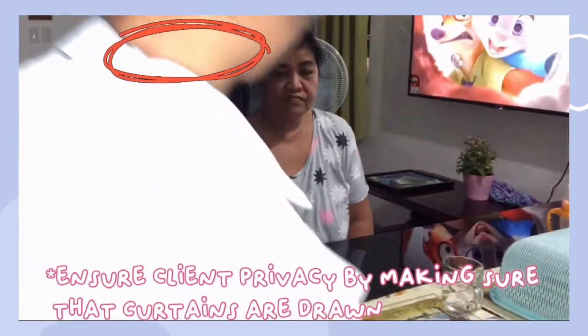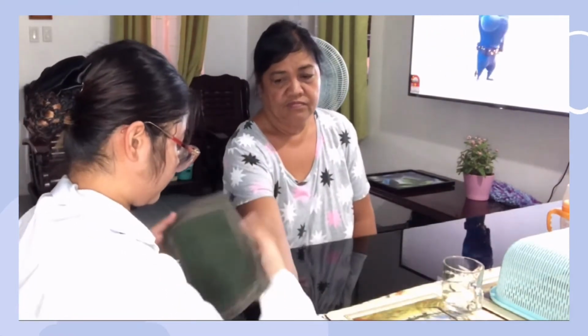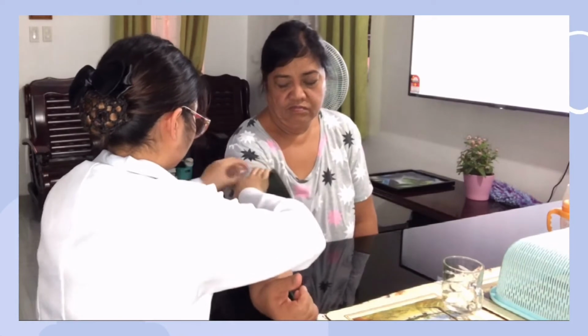Provide client privacy and place the client in the appropriate position. The adult client should be sitting unless otherwise specified. Both feet should be flat on the floor. The elbow should be slightly flexed with the palm of the hand facing up and the forearm supported at the heart level. Expose the upper arm.